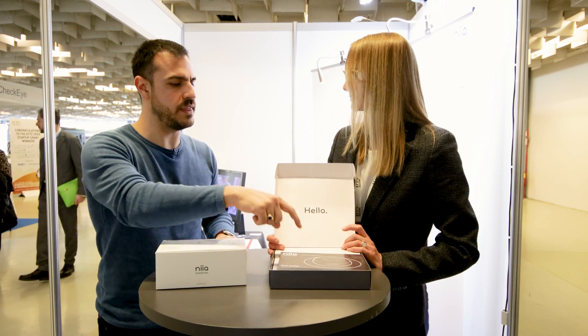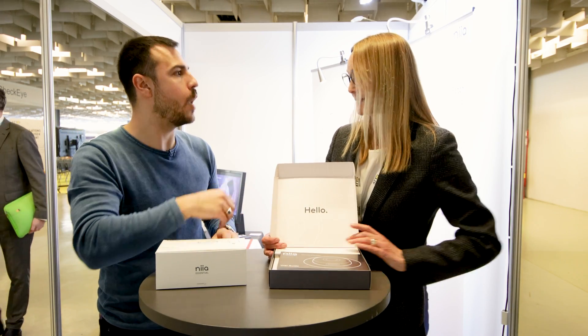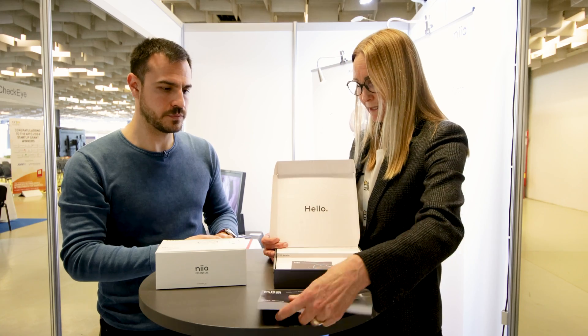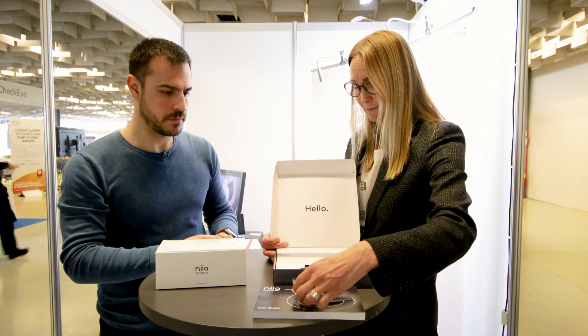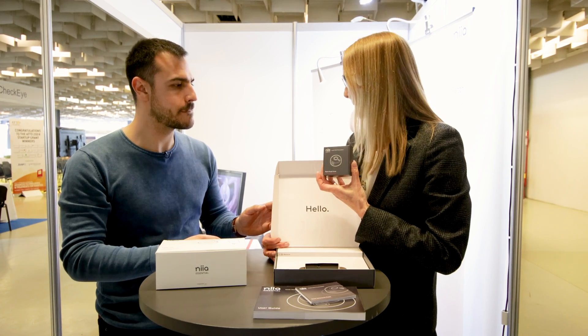And how long do these parts last? Two years, actually. So the main reusable part of the pump lasts two years.